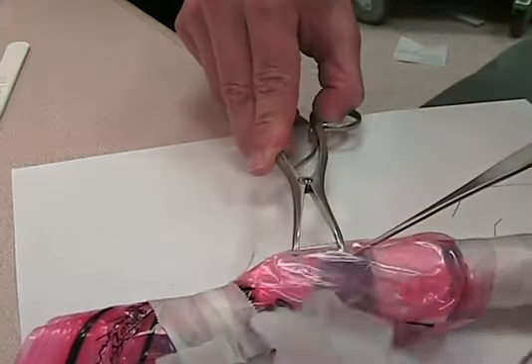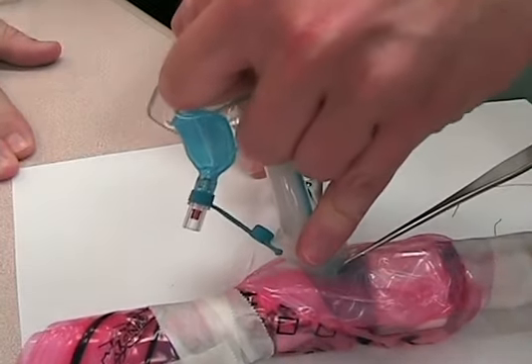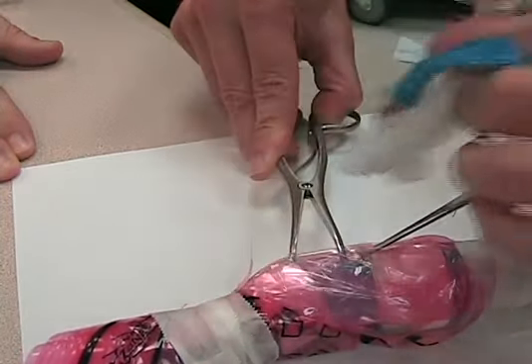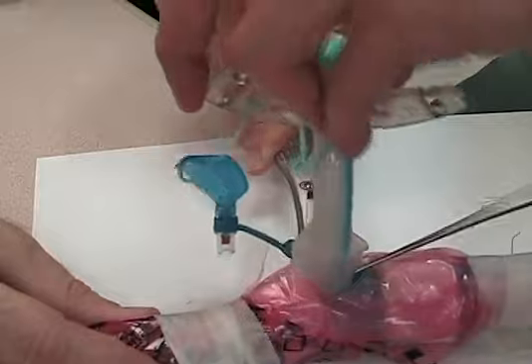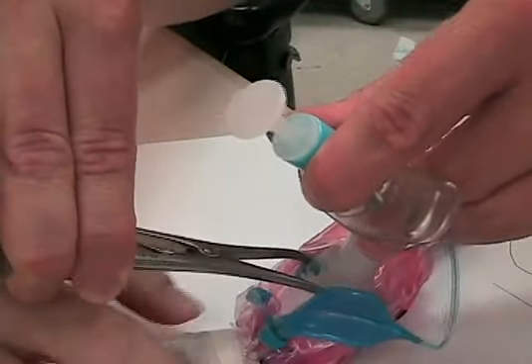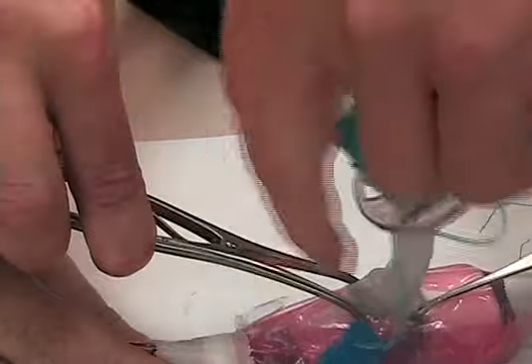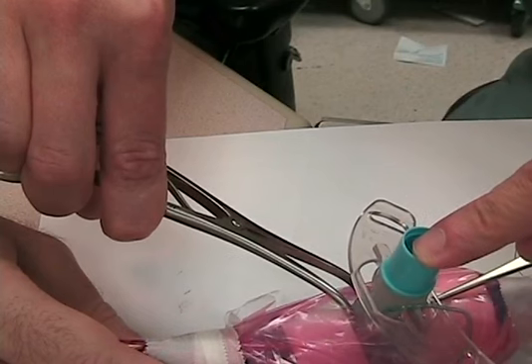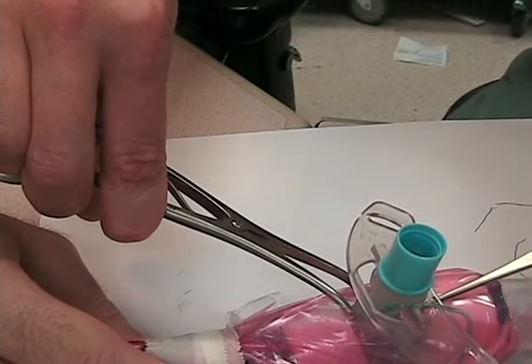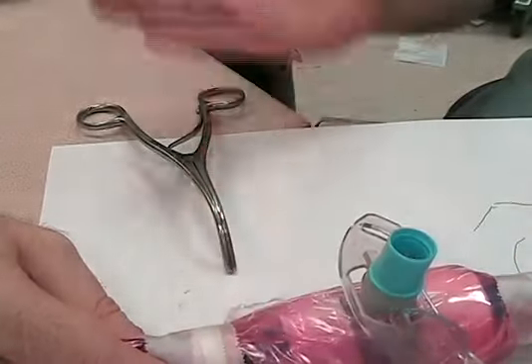Now, preferably grab the smallest trach you can find because it's much easier to secure. If you have a trach, you go in towards the trousseau dilator — not straight in, but from the side in towards the trousseau dilator. Then your trousseau dilator and the trachea rotate in one motion, so the trousseau is now facing down towards the patient's feet. Only then do you advance into the trachea. Once you're in, inflate your balloon and test with end-tidal CO2 that you're in. Once confirmed, gently take out your trousseau and gently remove the hook — you're golden.